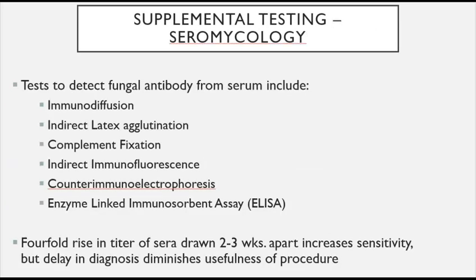For seromycology testing, there are several tests that we can use to detect fungal antibodies from serum, and they include immunodiffusion, indirect latex agglutination, complement fixation, indirect immunofluorescence, counter immunoelectrophoresis, enzyme-linked immunosorbent assay or ELISA testing.